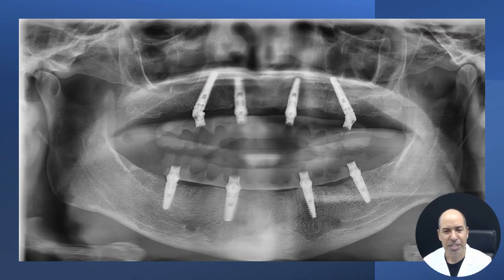Here's her profile. She's looking good. She feels good. And this is what she looks like the next day of the surgery. I mean, that's literally 24 hours later. It was just amazing to go from where she was to this, but it's not perfect. Let's talk about how it wasn't perfect. Very nice overall, but she used to have an overbite, so she's still kind of getting used to what it's like to not have an overbite. So she wears it for a while.